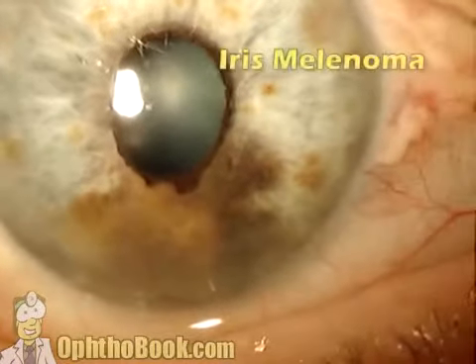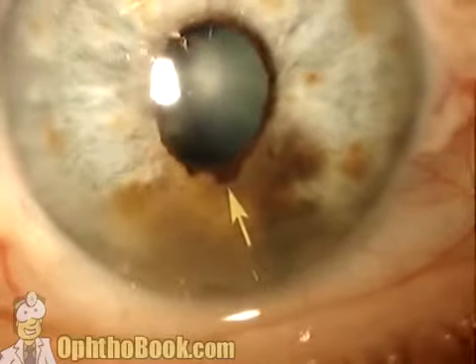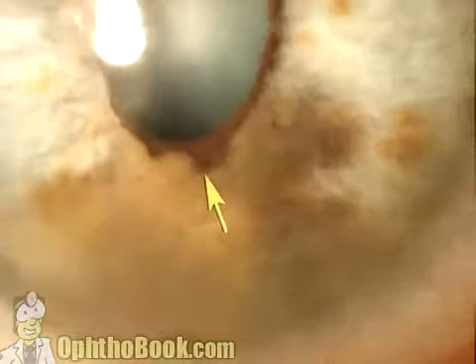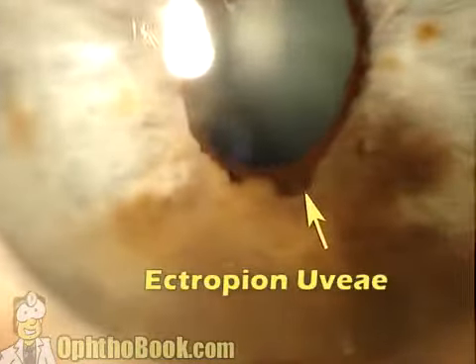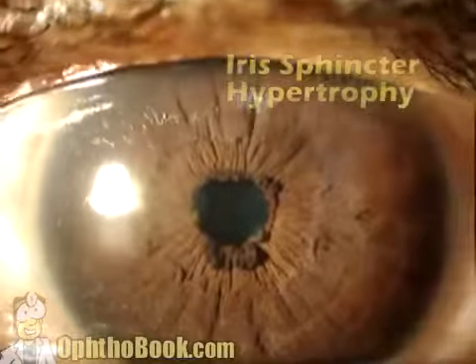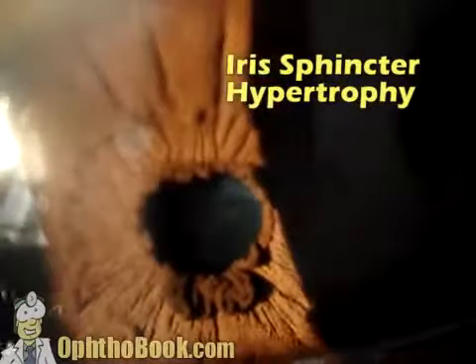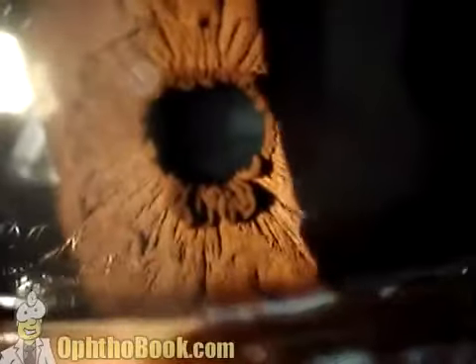This is a melanoma on the surface of the iris, and if you look closely, you'll see sort of a pigmented ruff right on the bottom edge of that pupil. This is what we call an ectropion uveae, and this is the back of the iris, which is pigmented, being pulled forward through the pupil onto the front of the eye just from contraction of this cancer on the surface. This is basically a hypertrophy of the sphincter muscle that controls pupil constriction. It just looks big and is giving this sort of a purse string appearance to the eye.